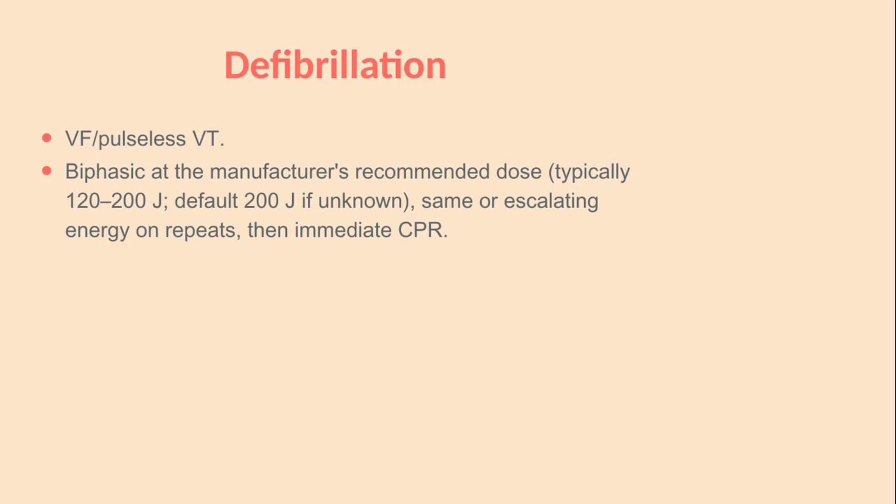That single habit, immediate CPR after every shock, protects the compression fraction that drives survival. Escalate energy for refractory fibrillation if your device allows. Consider changing pad position, and keep the epinephrine and amiodarone sequence running alongside the shocks.